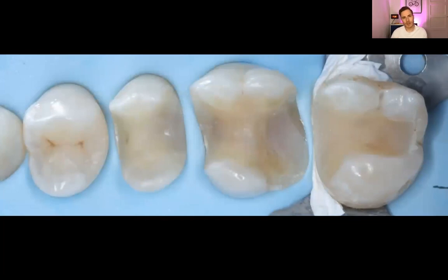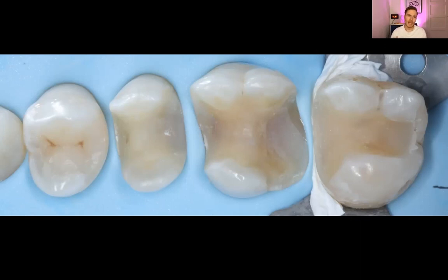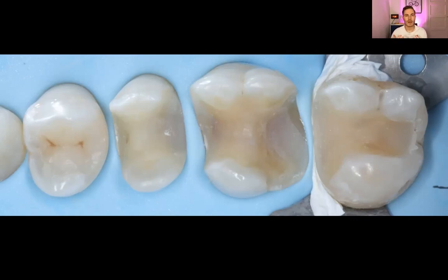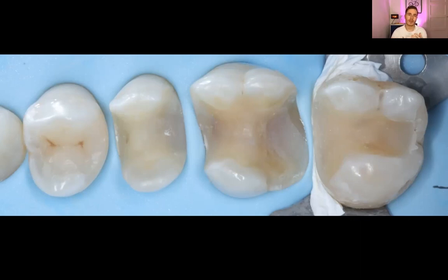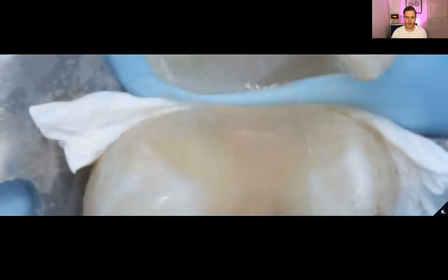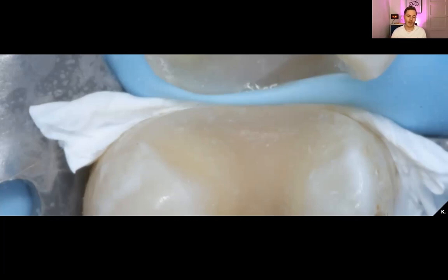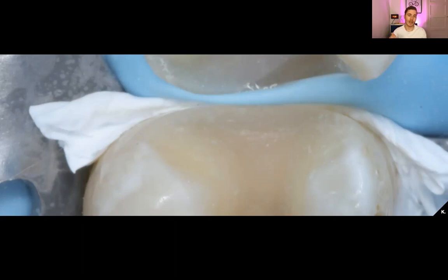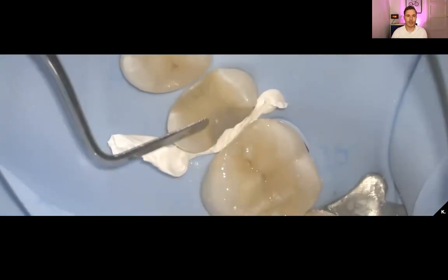When I'm going to cement these restorations, even though the outline is properly exposed, I always want to use a little bit of Teflon to create a little bit of space between my outline and my indirect restoration. By creating this space — usually around one millimeter — I give myself the chance to remove any excess of my heated composite, making it easier to get a smoother transition between my restoration and the outline of the tooth. Here you can see a close-up picture of the Teflon creating a little gap between my rubber dam and the tooth, giving better retraction and more space. It's not an easy technique and I always use two instruments — a flat plastic and a periodontal probe — to guide the Teflon apically in between the rubber dam and the tooth.